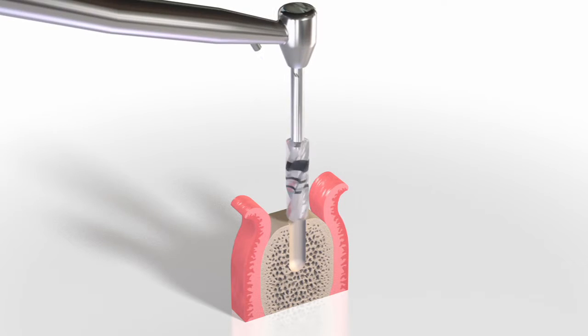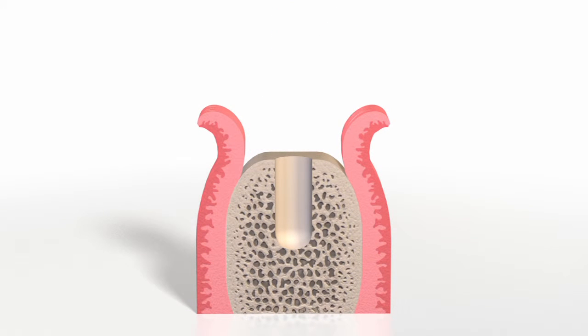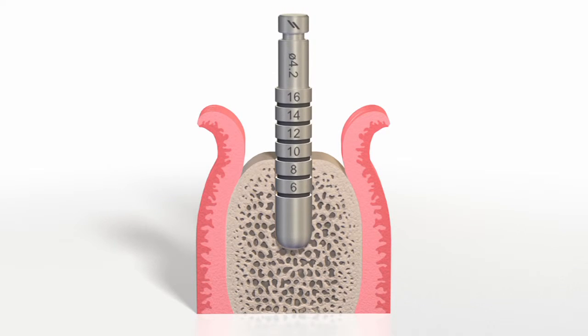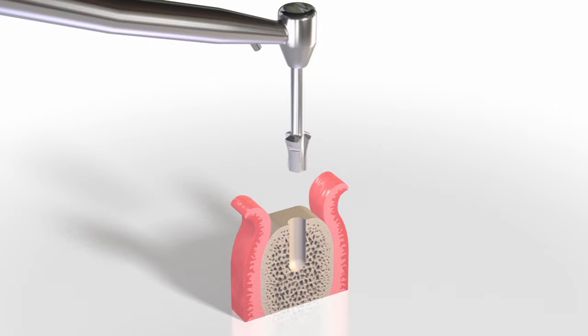For 4.8 millimeter implants, the 4.2 millimeter Straumann Twist Drill Pro now is required. The final preparation depth is confirmed with the 4.2 millimeter depth gauge. The SP profile drill is needed to prepare the implant bed for the Standard Plus implants, whatever the bone class may be.